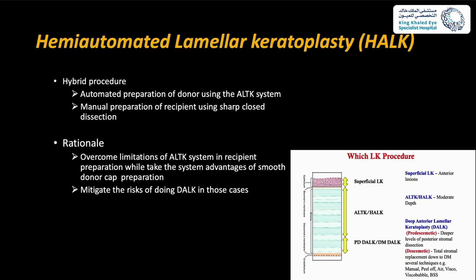Okay. So, talking about HALK. HALK, basically, as the name implies, is a hybrid procedure. It involves the automated preparation of the donor using the ALTK system and manual preparation of the recipient using sharp closed dissection. What is the rationale behind HALK?